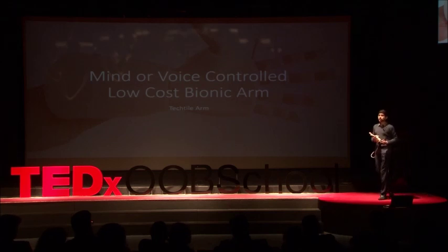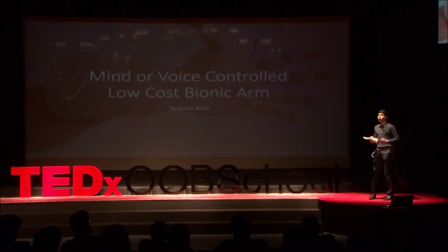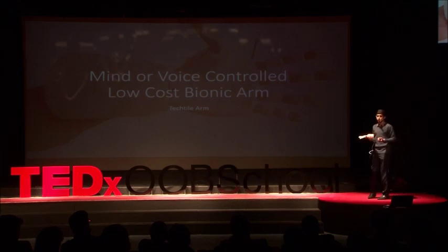Another feature which is added thanks to 3D printing is speed. So when I decided I was going to give the prosthetic hand to the amputee, in conversation with him, he had once mentioned to me, "Diwali se pehle haath milega kya?" Which means, can I get the hand before Diwali? And this being just 2 weeks before Diwali, with conventional prosthetics would have been impossible.